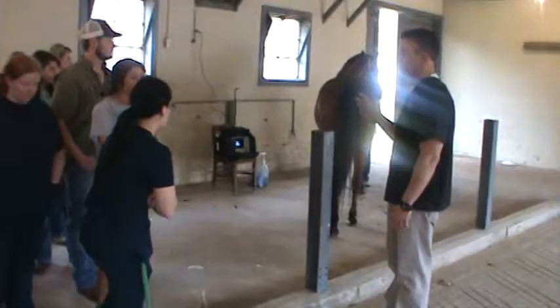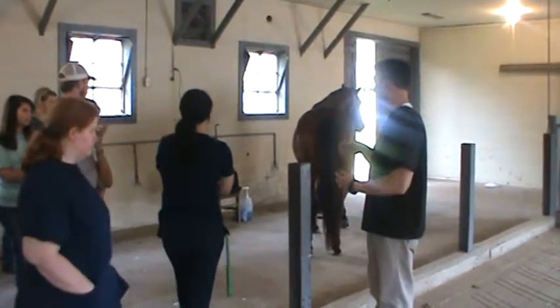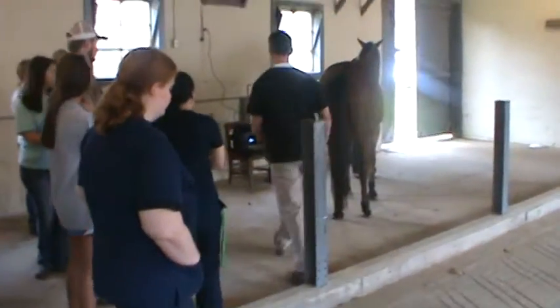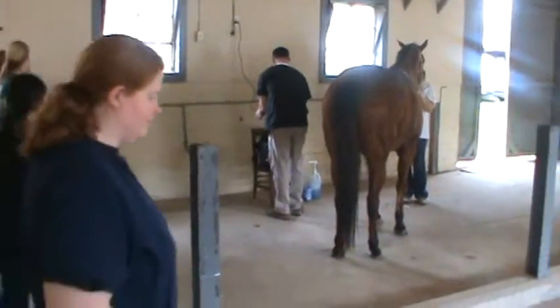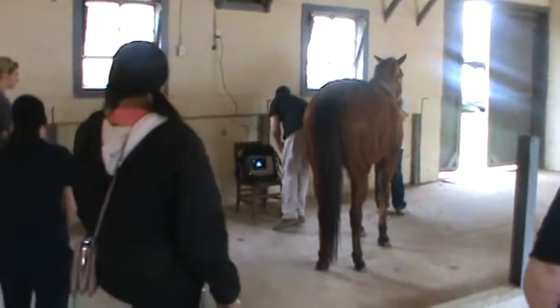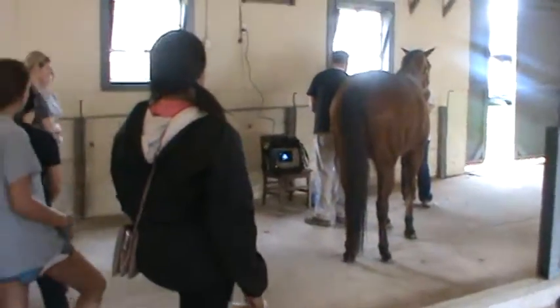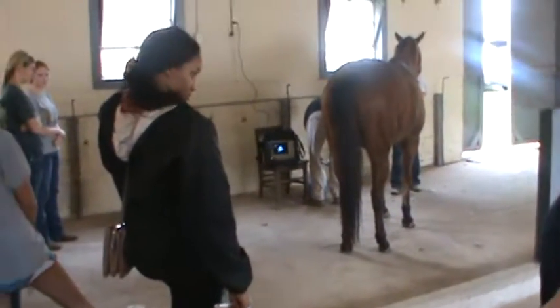What I need is one of you to volunteer. There's a freeze button on the ultrasound machine. You may not actually be able to see it until we freeze it and then let you walk by it. Okay, so somebody can hear. Just hit the freeze button when I tell you to, and then all of you will be able to see it. Not everybody at once.